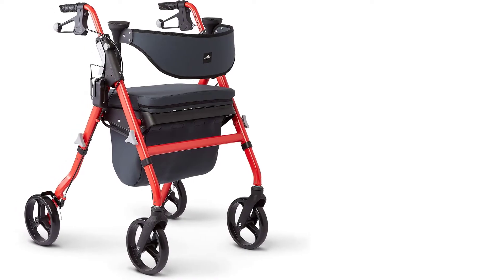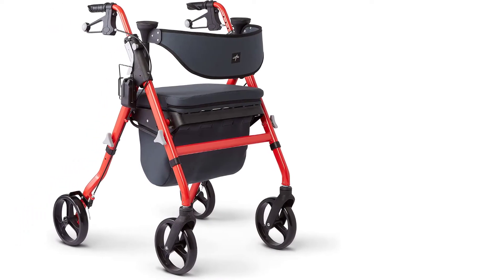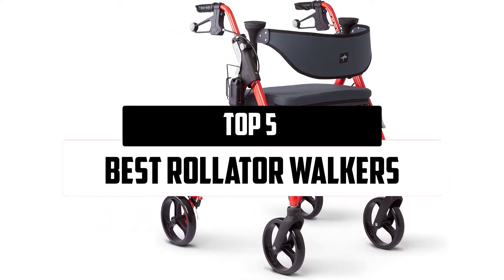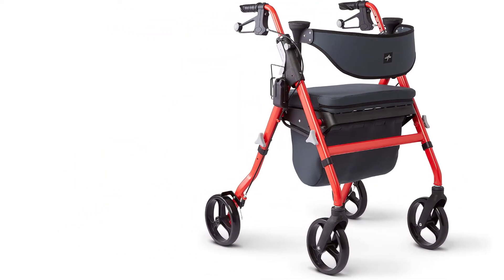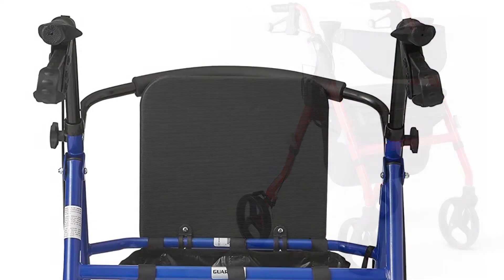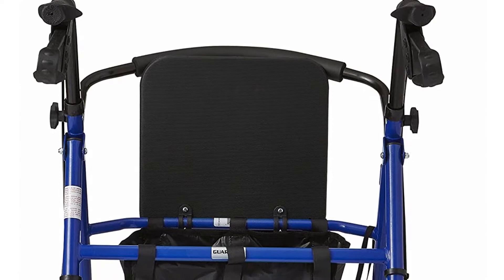Hello everyone, welcome to our new video. In today's video we break down the top 5 Bustrolator walkers that are available on the market. I tried to make the list based on their popularity, quality, price, durability, user opinions, and more.